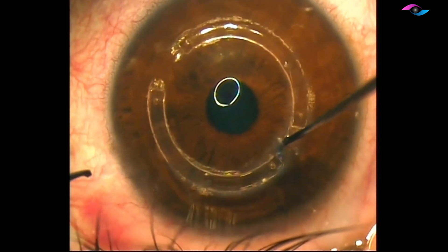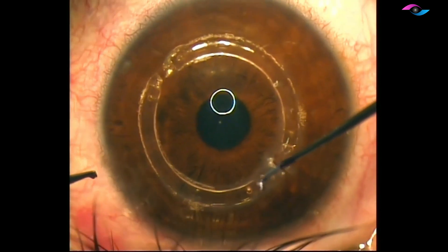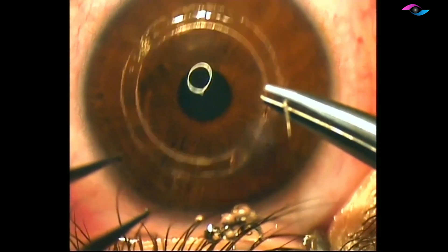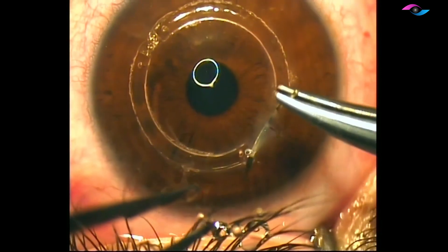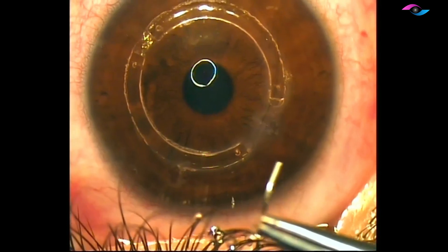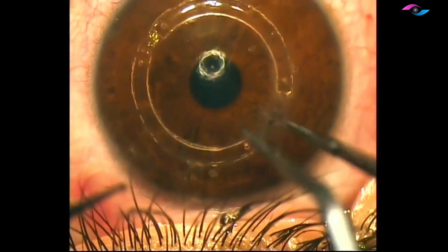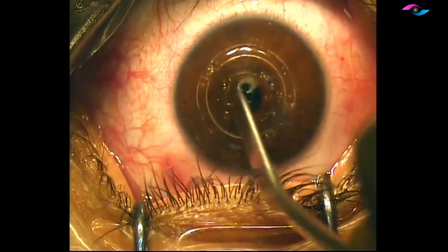We are nudging the segments inside so that they are not close to the incision and also so they don't touch each other. At the end, I like to place a 10-0 nylon interrupted suture to ensure that we do not have any extrusion of these segments. This suture is then buried and removed typically after one month of surgery.